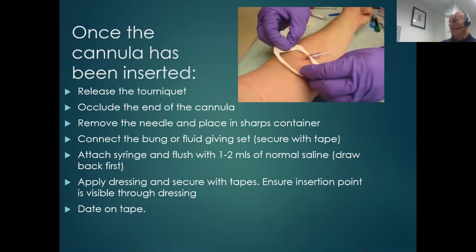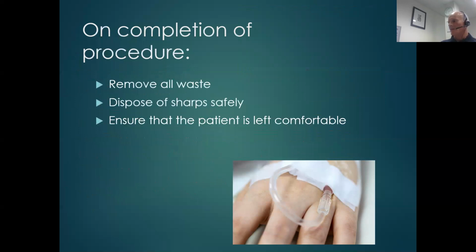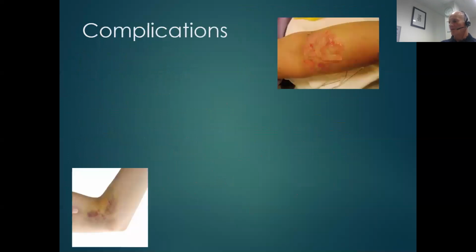Date on the tape. Okay, on completion of the procedure, remove all waste, disposal of sharps safely, ensure the patient is left comfortable. Hand hygiene on leaving the patient, or if you're staying there, wash your hands. Documentation. Okay, some of the complications that can happen.